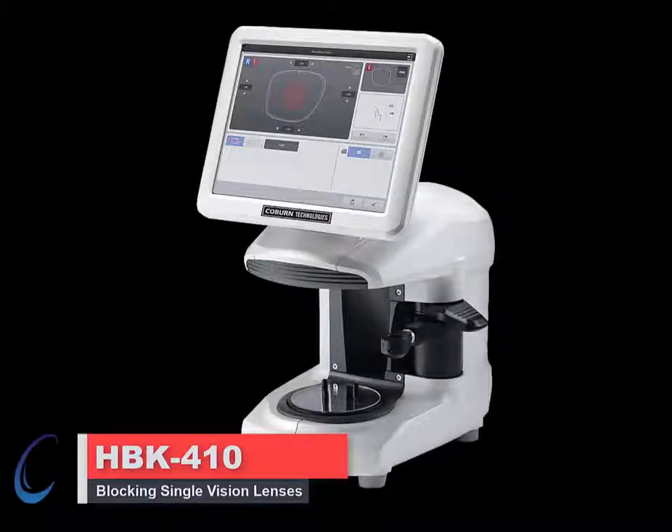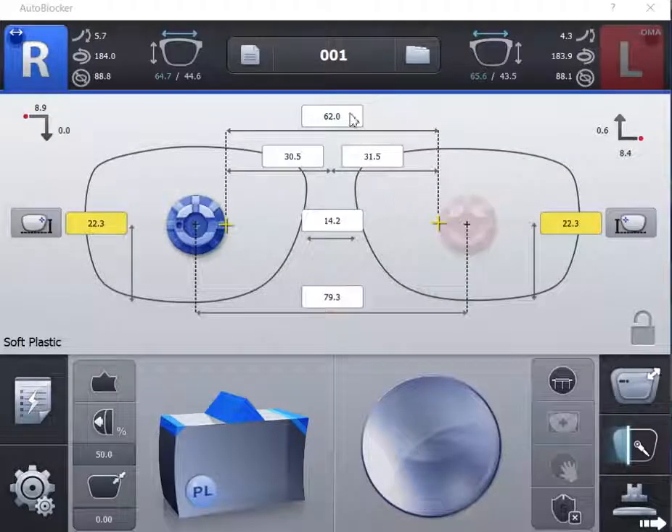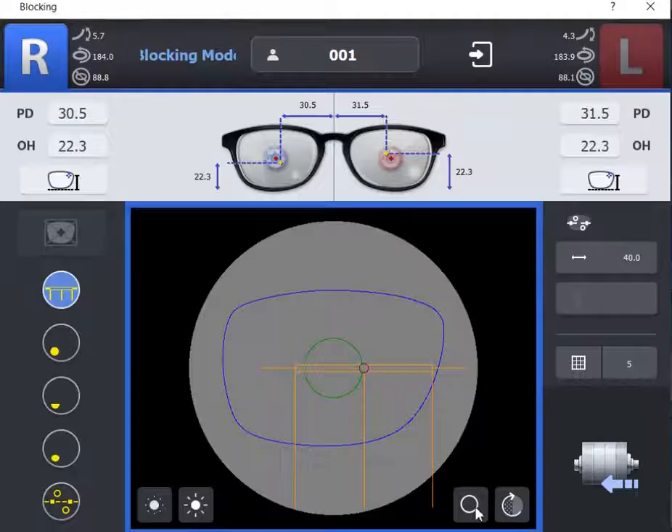The HBK410 Smart Blocker. Manual blocking single vision lenses. Once the frame is traced, verify all the required information. Select the blocking icon, then select the single vision icon.